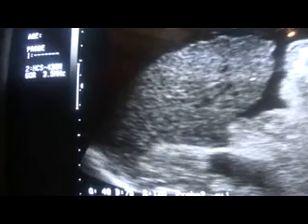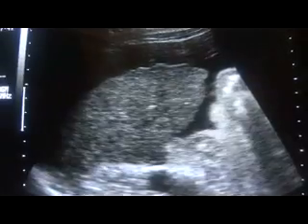I can see a focal lesion within the posterior wall of the uterus, which is giving whirly appearance, echogenic, solid, no posterior wall acoustic enhancement. This is the fibroid, leiomyoma.